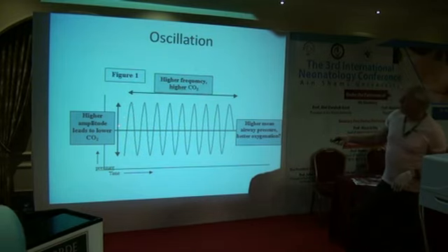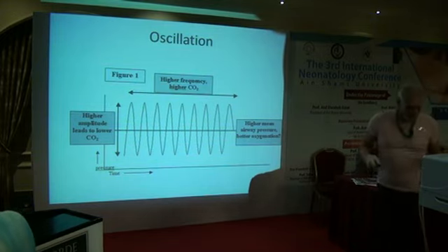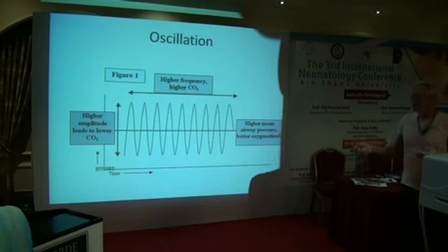And so all we're doing really is we set the frequency as to how fast this is going to occur, and then how vigorously do we wobble. So for me, the whole concept of high frequency is very, very easy, because you're just wobbling around a peak. You're just wobbling around your mean airway pressure. I think it's an easy concept.